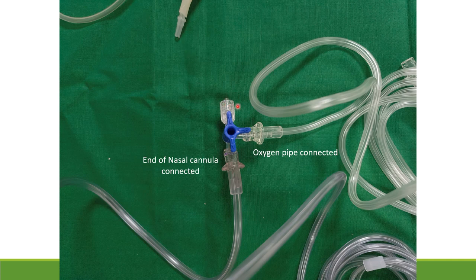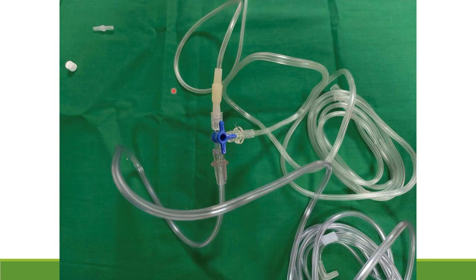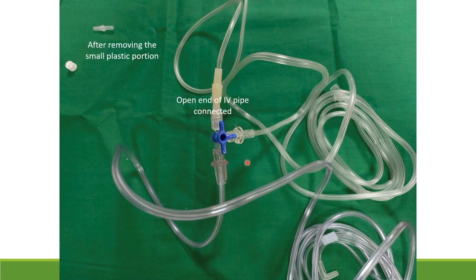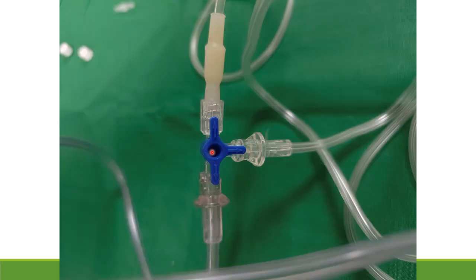Before attaching the IV pipe, you'll notice there's a small plastic piece on the end — you can't attach it as-is. Remove the plastic piece, and then the rubber end will easily attach to the open end of the three-way stopcock. Once attached, the three-way stopcock will have one end connected to the open end of the IV pipe.